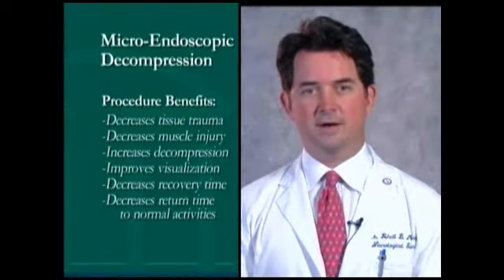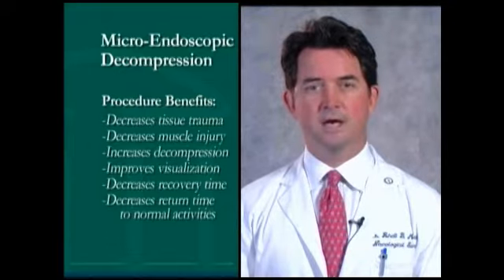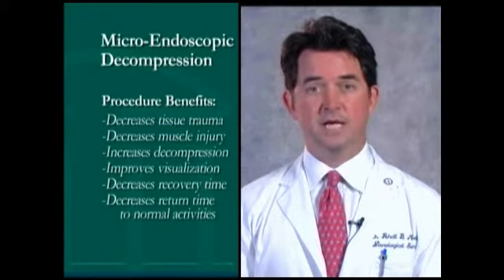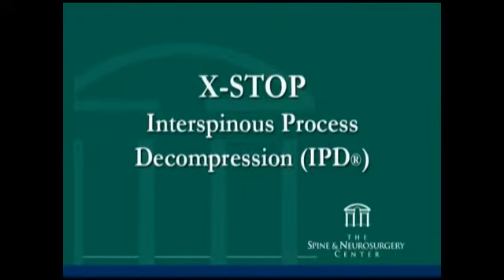The benefits to microendoscopic decompression are diminished tissue trauma, diminished muscle injury, an increase in the amount of decompression, and improvement in the visualization of the neurological elements. This technique decreases recovery time as compared to the classic lumbar laminectomy and decreases the time it takes to return to normal activities. A newer technique to treat lumbar spinal stenosis is the X-stop. This is an interspinous device which provides decompression of the lumbar spine.